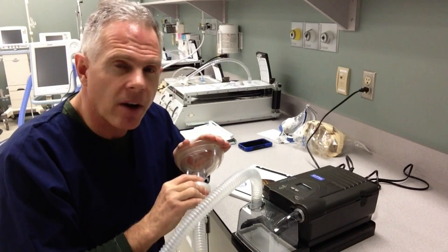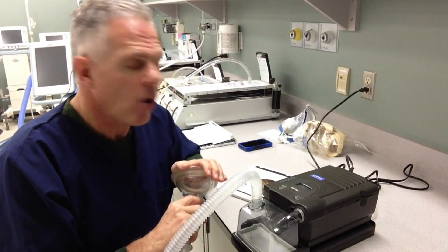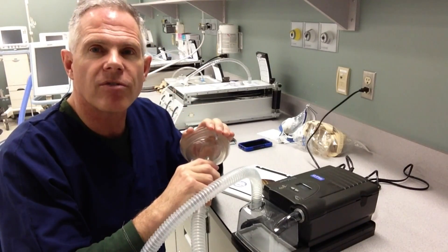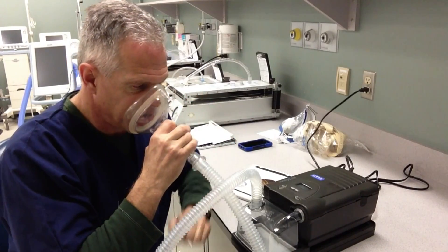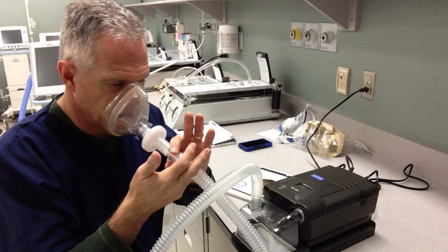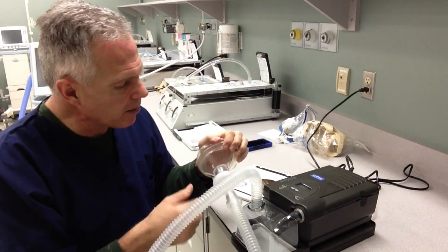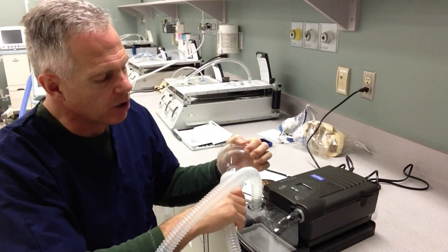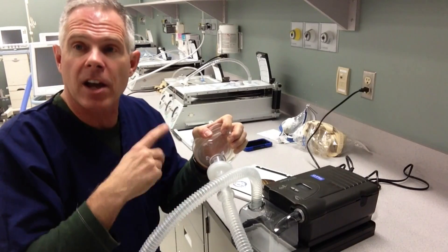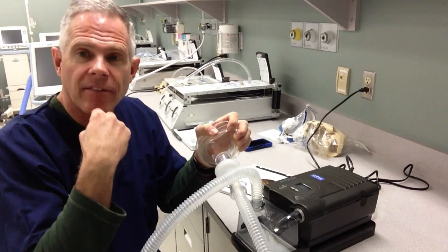There's very little monitoring on this particular device. It doesn't tell us about the respiratory rate of the patient, and it doesn't show us the tidal volumes the patient's receiving — it's just going to deliver that constant positive airway pressure. When you're breathing on this system, you should be able to feel that little bit of air constantly leaking out and around the whisper swivel here.